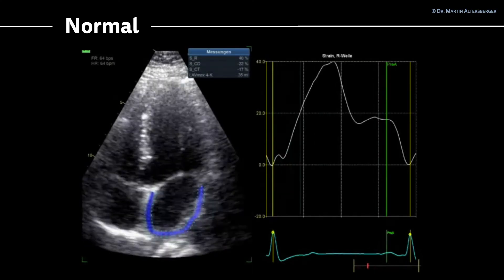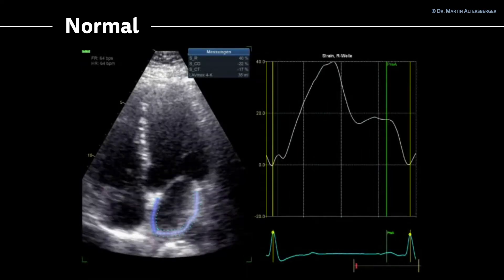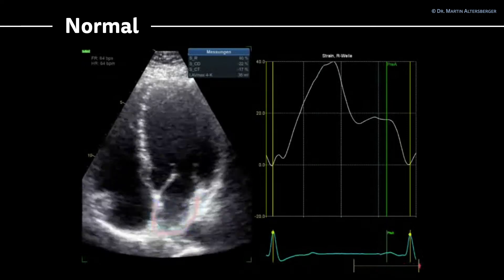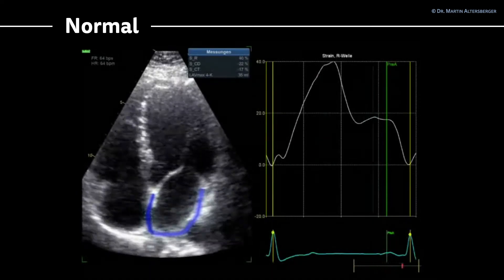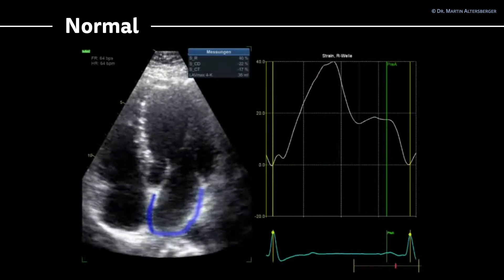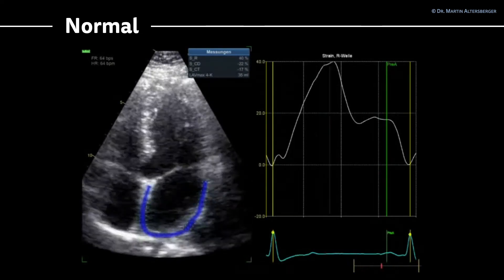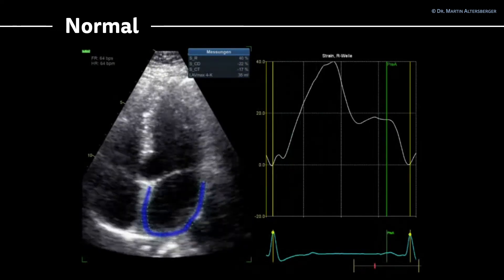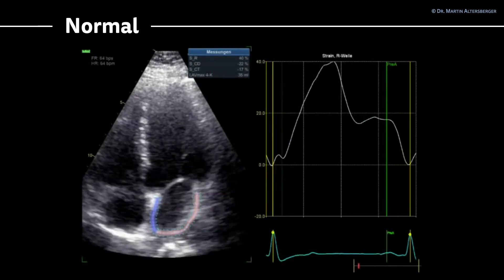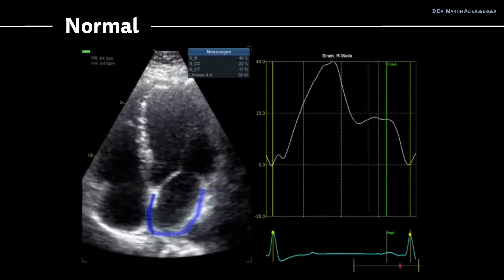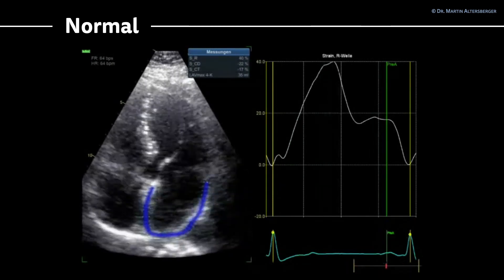To see a normal example, we can visualize it in this image or in this loop. The left ventricle is normal in size with a normal ejection fraction. The left atrium is also normal in size — the overall volume is 35 milliliters, which with a body surface area of 1.7 to 1.8 is of course a normal value. On the right hand side we see the left atrial strain, showing the contraction phase at the end — the so-called PACS — which has a normal value of approximately 17. This concludes the important parts of left ventricular filling.